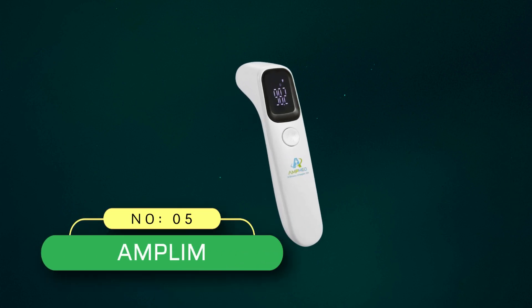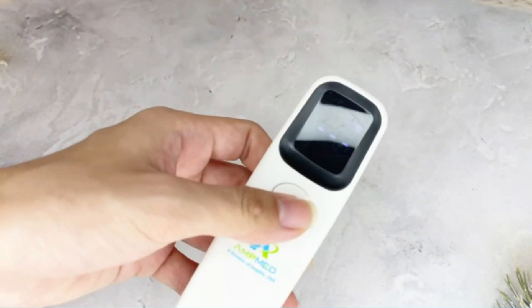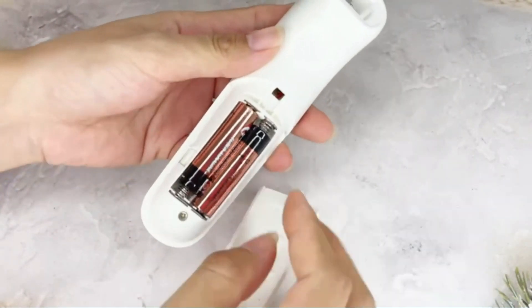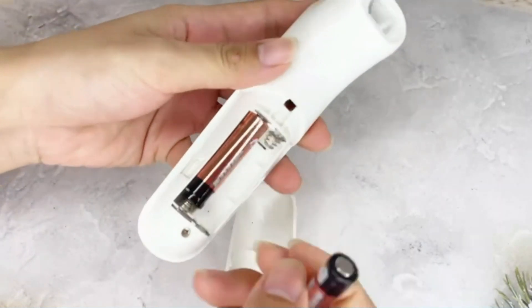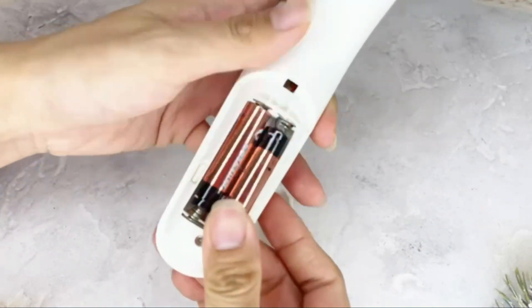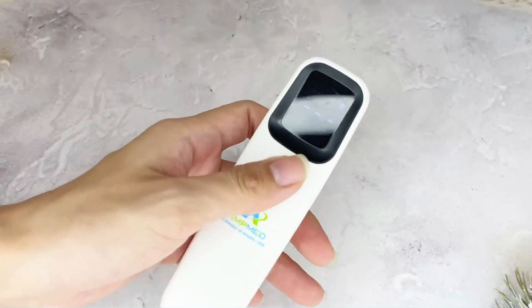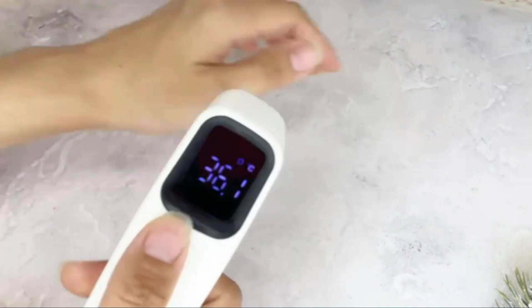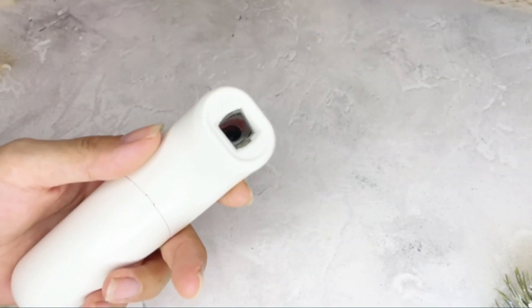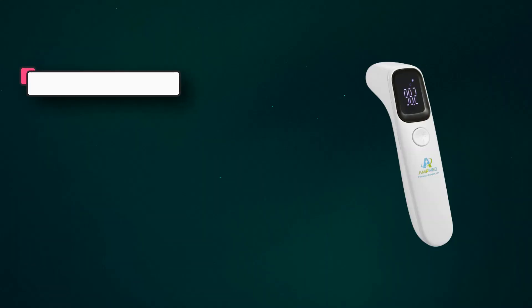Number 5: Amplum contactless thermometer made in USA. The Amplum forehead thermometer is touch-free, making it a hygienic way to measure body temperature without any physical contact with the skin. It is clinically proven for use at home, in clinics, or at the workplace. With high precision infrared sensor technology, this digital thermometer provides accurate temperature readings in just one second. It can be used to measure body temperature for all ages, including babies, kids, and adults.